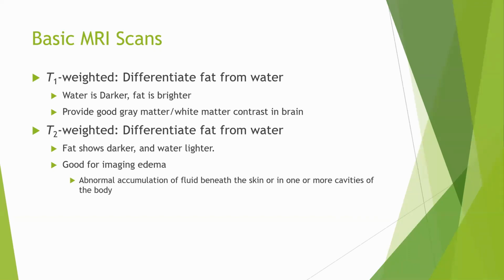what is the purpose of MRI? MRI, as I said, is not the first thing you want to see. You will take your history, your medical history, you will take your evaluations, orthopedic evaluations. You will also see the first order diagnostic tool, that is your X-ray. After that, if you feel there is something beyond bone, some amount of anomaly, trauma, injury to soft tissues, it could be contractile soft tissue injury or non-contractile soft tissue injury.